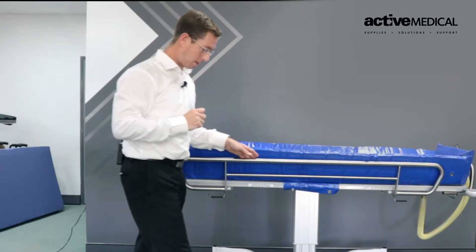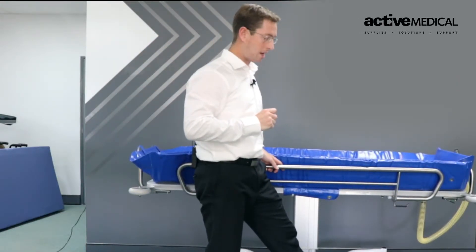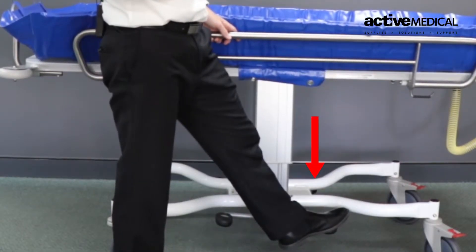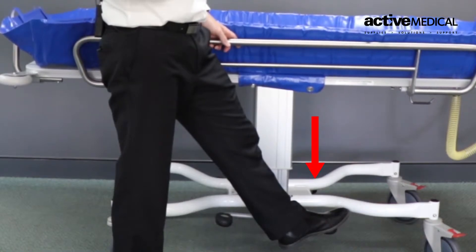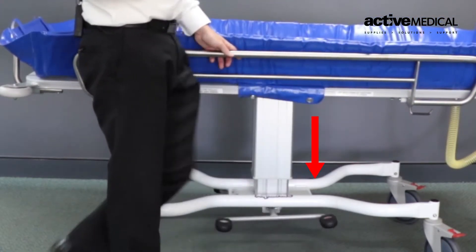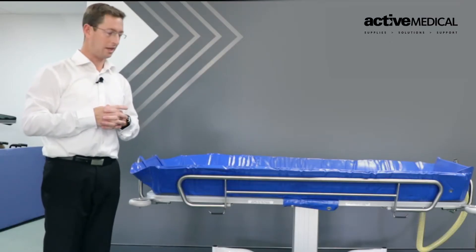To lower the shower trolley, I simply step once on the lower tab, which is red, and lower the product down. Under any weight, it will come down at a controlled slow speed to ensure everyone is safe and the patient or resident is not at risk of being injured or feeling insecure.